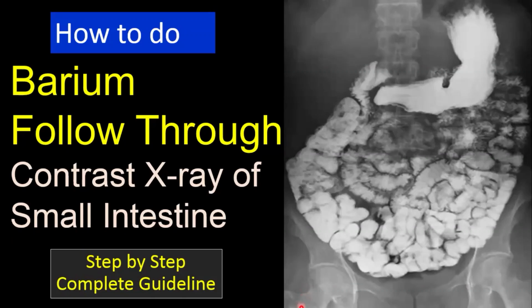Welcome to another tutorial video, and this is the fourth video of my contrast X-ray playlist. Previously I have uploaded about IVU, barium swallow and barium meal, and this next tutorial is about the barium follow through. So hope you will enjoy it. So without further ado, let's start.